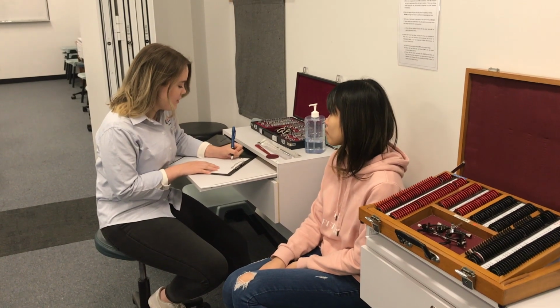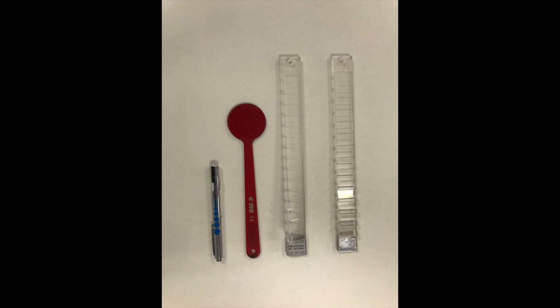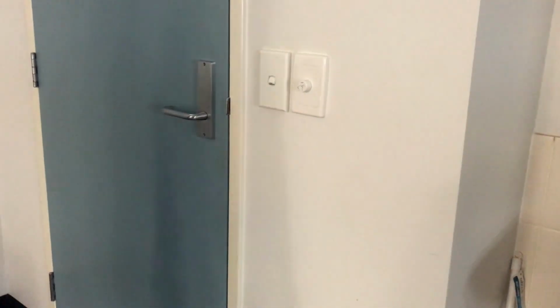After confirming the patient's details and a thorough history taking, we begin testing the Maddox rod. The equipment you will need include a Maddox rod or a trial frame with a Maddox lens, a light source and a prism bar. In order to perform this test accurately, the lights in the room should be dimmed.